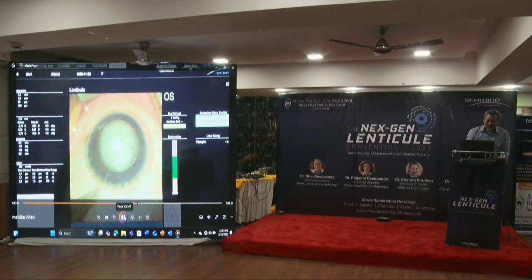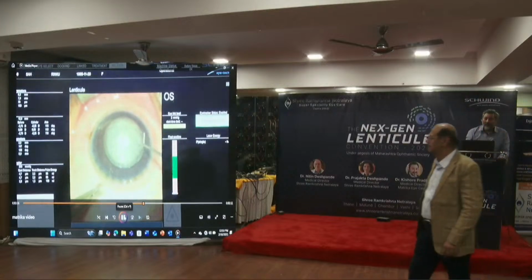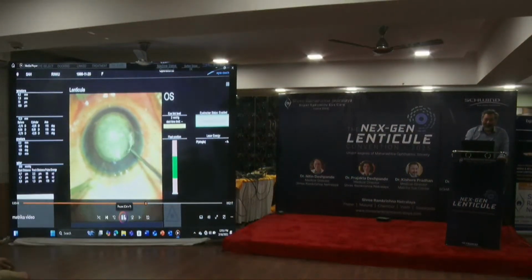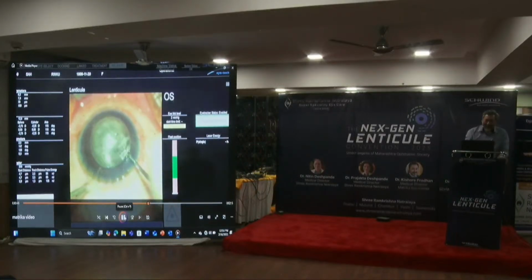So now I'm entering, try not to move. Very good. Move around. So I tell the patients, if I scold you too much, don't worry, I will not beat you, but over the lenticule. I'm going. Then I go under the lenticule.